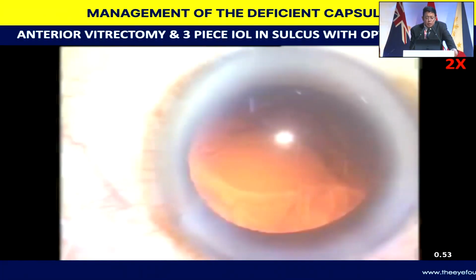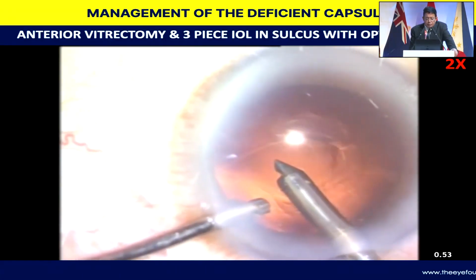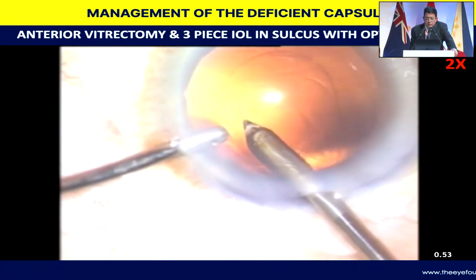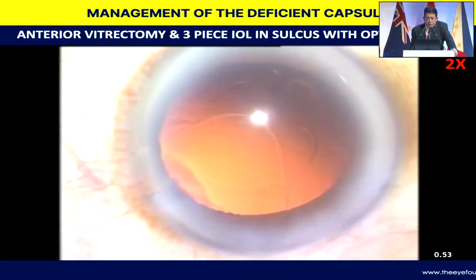This case I did about 25 years back. He was a physician from Ooty. As you can see over here, I had the primitive instruments. I have a large PC rent over here. You can see the anterior vitrectomy being done. Basically, the principles are remaining the same.